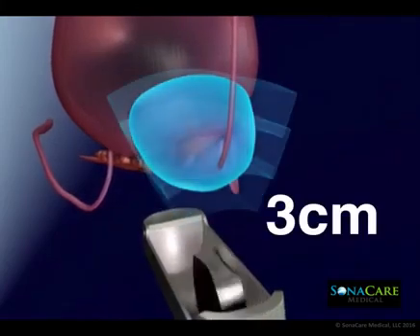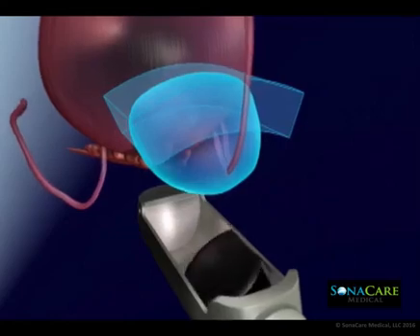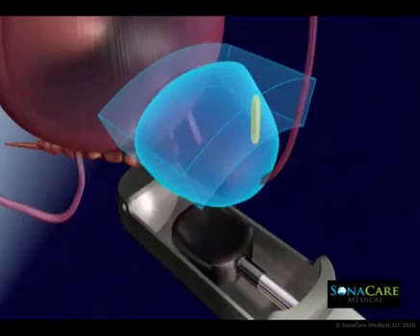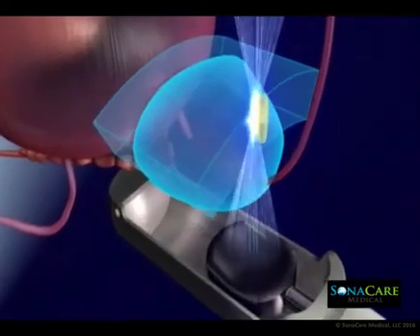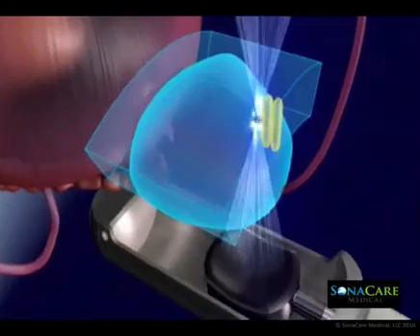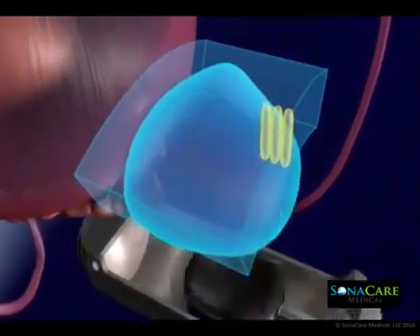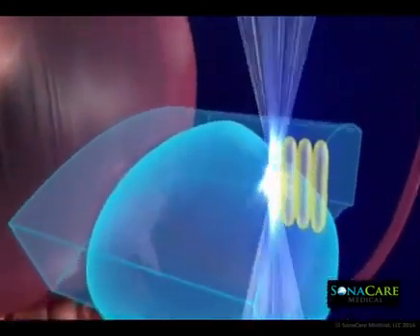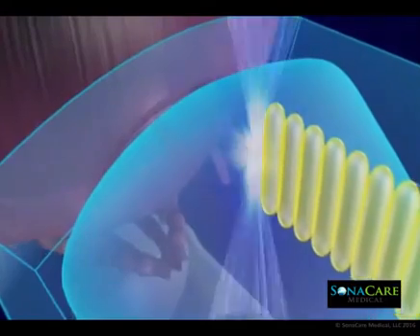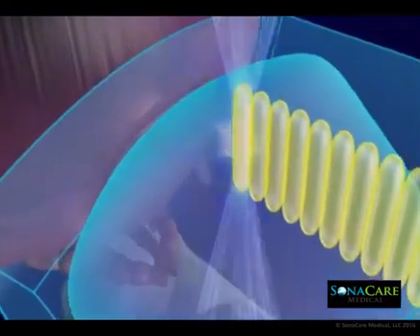This results in tissue destruction, while intervening tissue between the transducer and the focal zone remains unharmed. The result is an accurate and repeatable lesion at the target sites, monitored by the treating physician in real time. All ablation zones are pre-planned and checked by the physician prior to starting the HIFU procedure.